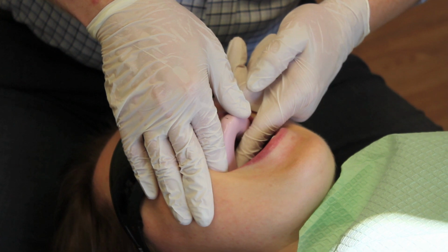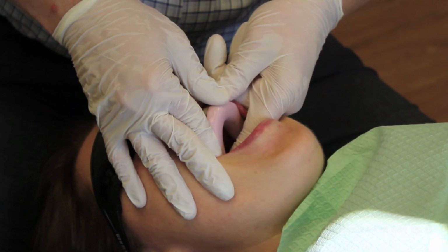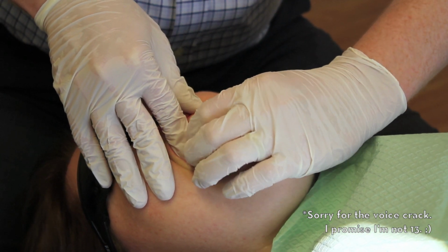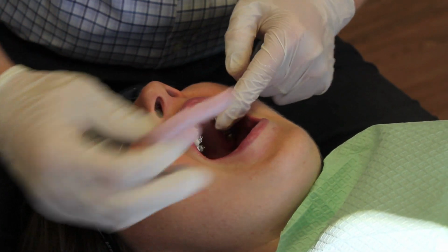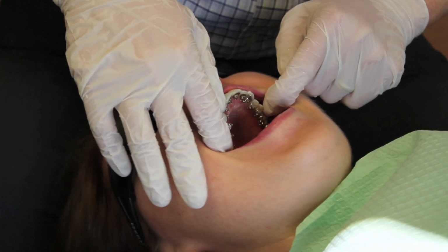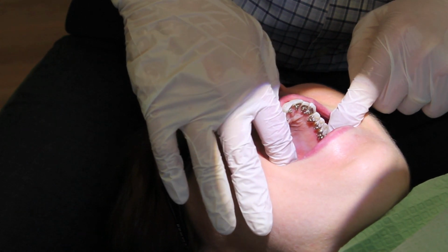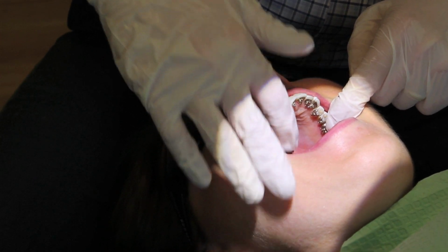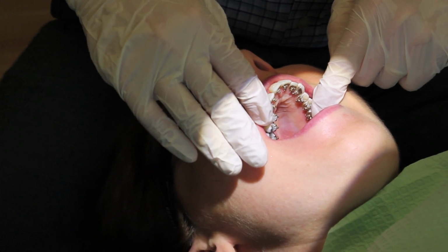Alright, so here we are taking off the custom tray, and we'll reveal to you the braces and what they look like. And so it takes a little bit of time to get the tray to pull off, but it's actually pretty easy. And so then you can see as we take the custom tray away, all the brackets are in place where they should be. Everything's fit perfectly to the teeth. It's made for the teeth on a computer. So it's pretty amazing stuff there. But you can see all the brackets nice and gold, and the great part is that you don't see them on the front.